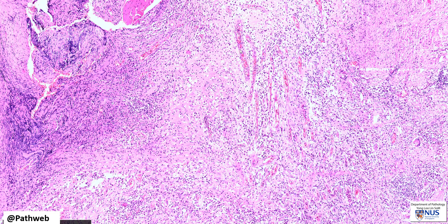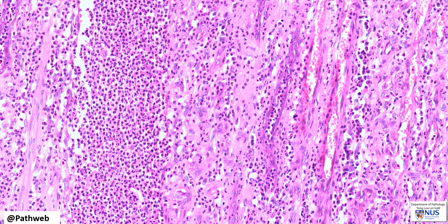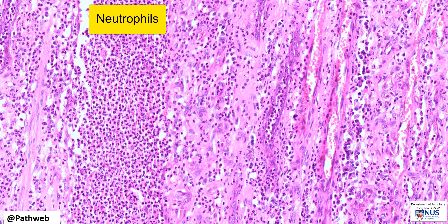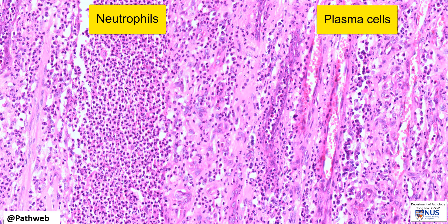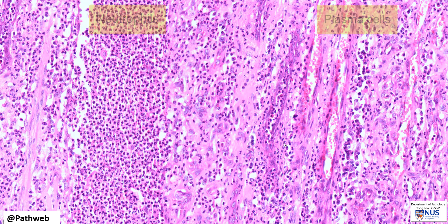Lower down in the tract, again we can see granulation tissue with lots of mixed inflammatory infiltrates. And on higher magnification in a deeper area, we see lots of neutrophils as well as many plasma cells. Hence, there is both acute and chronic inflammation and vessels from granulation tissue.